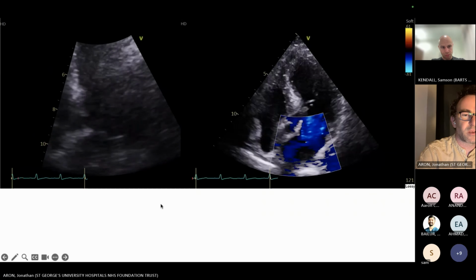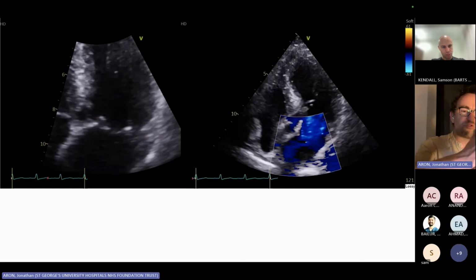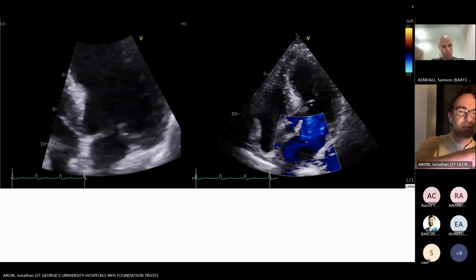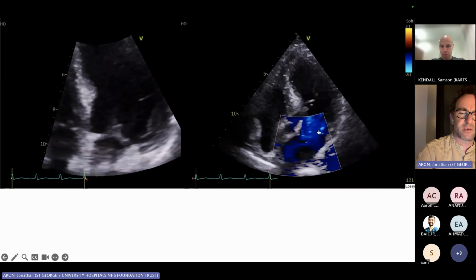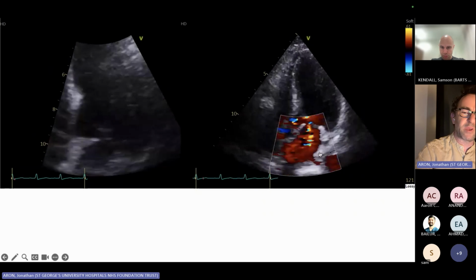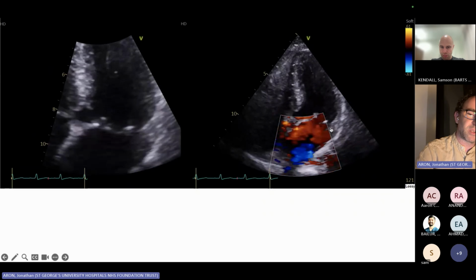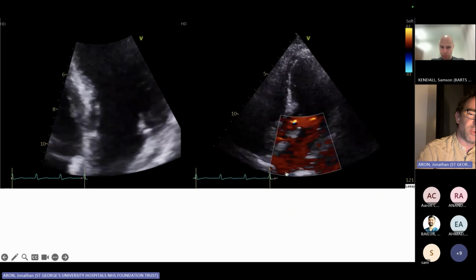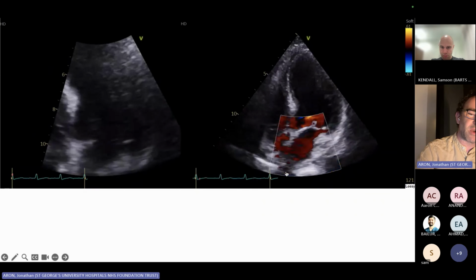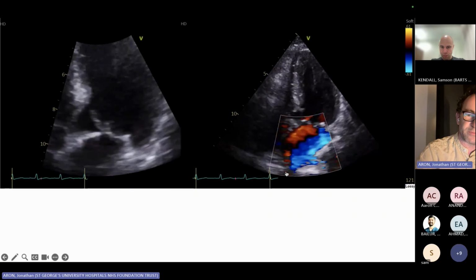I think you can probably see it there, the folded mitral valve being dragged into the jet stream, and it's ripping apart the mitral valve during systole and resulting in this very profound mitral regurgitation, which is coanda-ing, hitting the back wall. You can even see it going straight into the pulmonary veins, into the lungs, causing the pulmonary edema in itself.